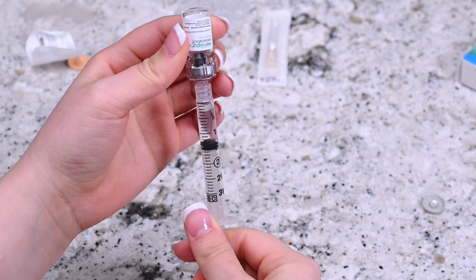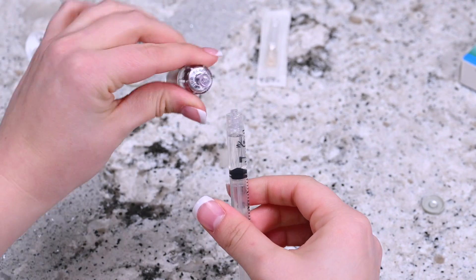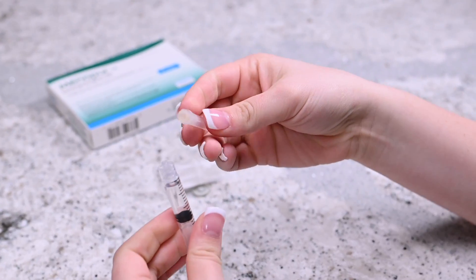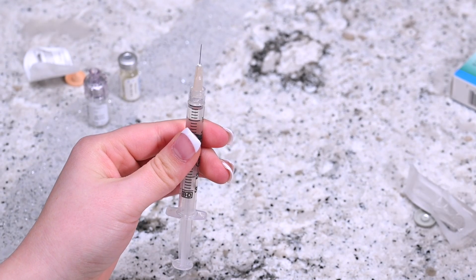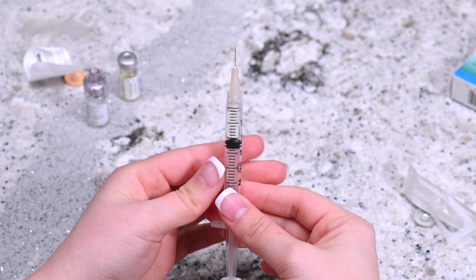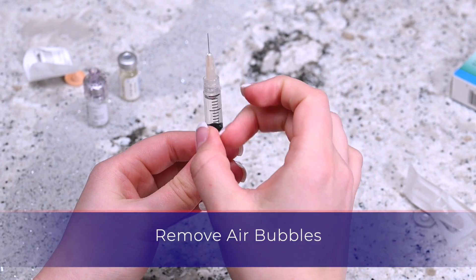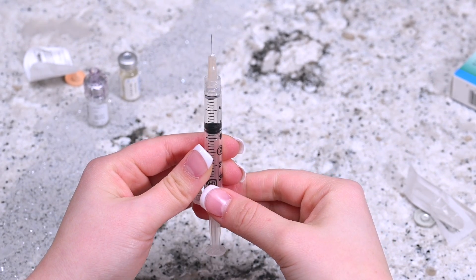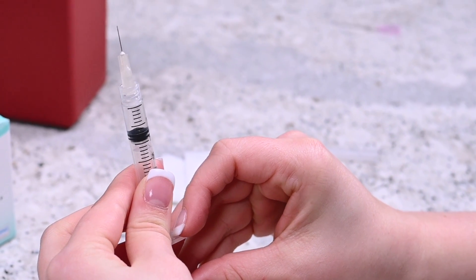Once finished, remove the syringe from the q-cap and the vial and set it aside. Remove the needle from its packaging and twist it into place on the top of the syringe. Hold the needle upright and remove the cap. Don't let the needle touch anything, including your hands. While holding the needle upright, gently tap the side of the syringe until the air bubbles migrate to the top. Apply slight pressure on the plunger until a drop of liquid appears at the tip of the needle.